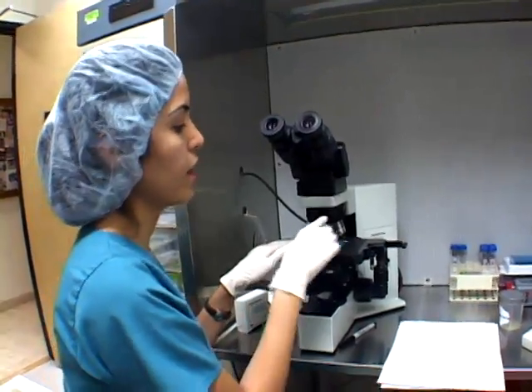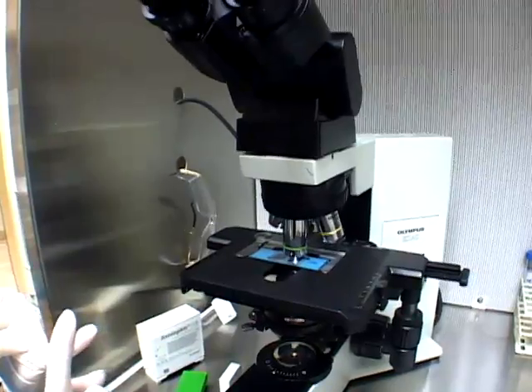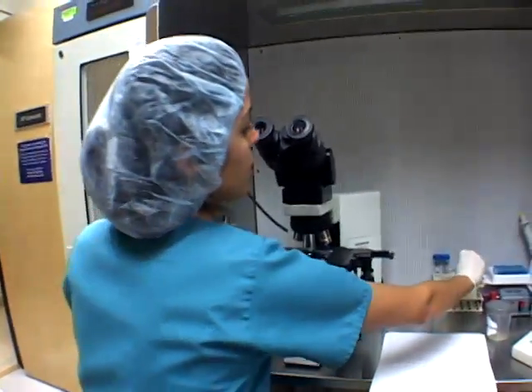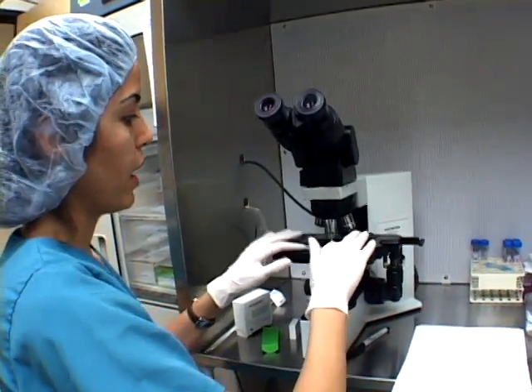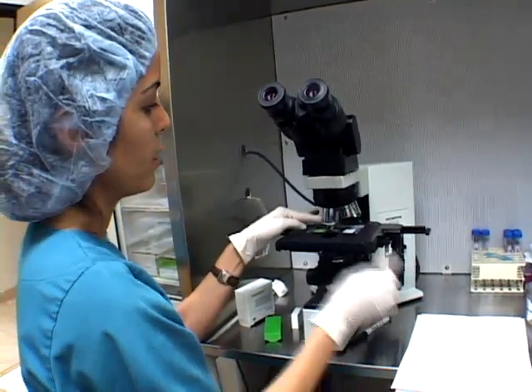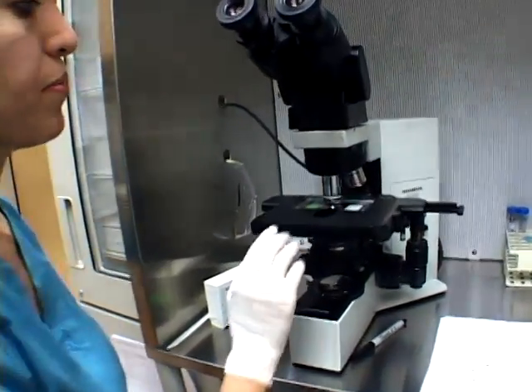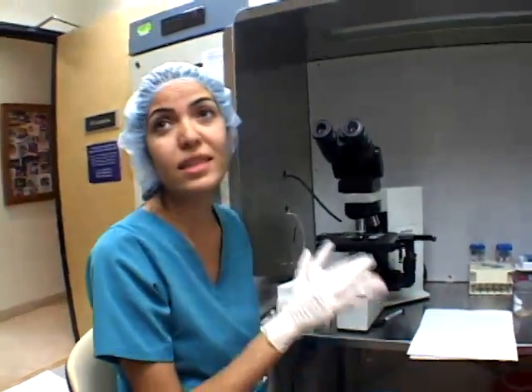This is the slide that I can look at the concentration and motility. And this is the slide I use to determine the morphology. Usually we use the bigger lens to see morphology. That's the first step.